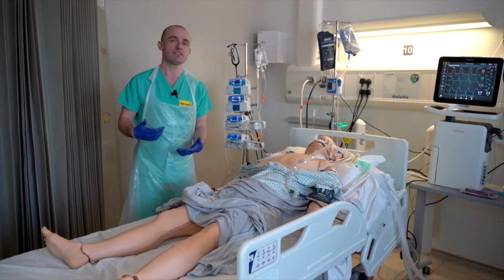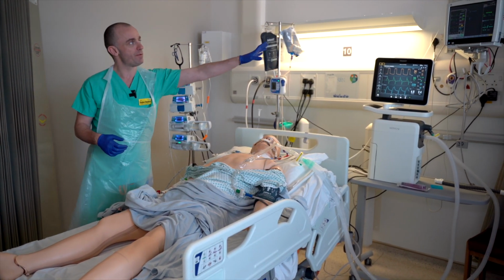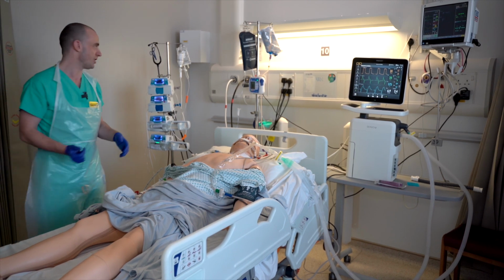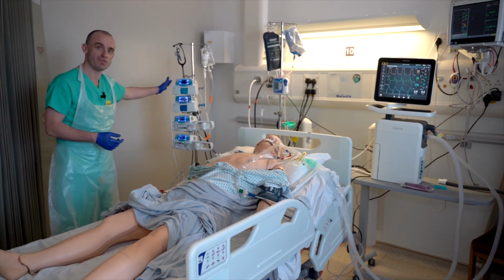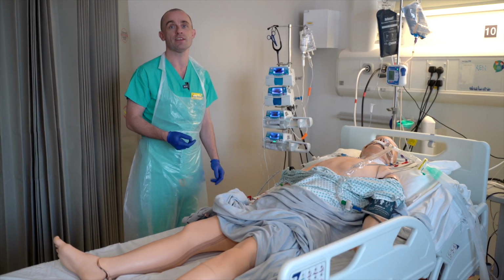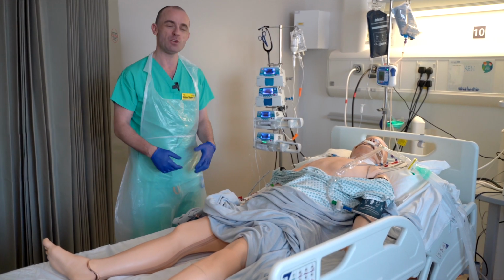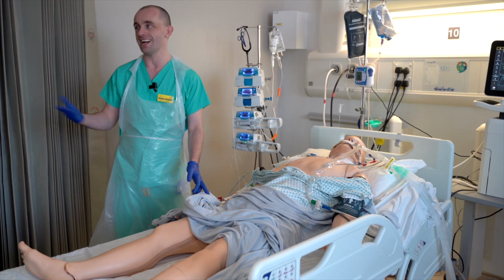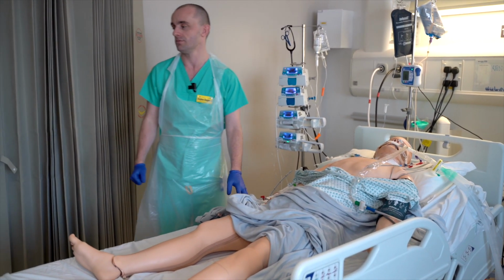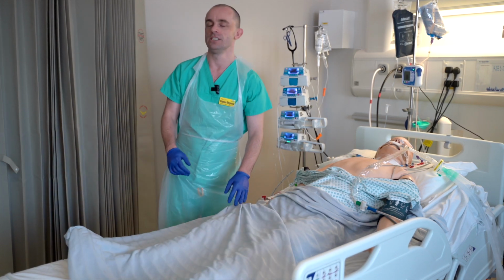Again, trying to integrate the information that we've got, we are seeing that we've got a blood pressure which is adequate, but it's important to know what we're doing to achieve that blood pressure. And I can see here this patient is on some infusions, one of which is a drug called noradrenaline and one of which is a drug called vasopressin, which are both drugs that are used to support the peripheral circulation. Again, you want to know what the trend is. So if I could ask, what dose of noradrenaline are we on, and is it going up or down? The dose is 0.1 mics per kilo per minute, and it's unchanged, and the same with vasopressin.